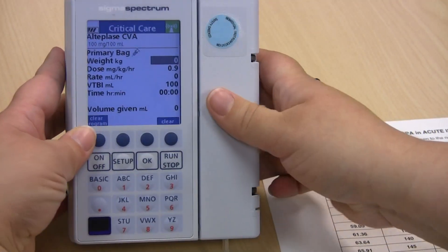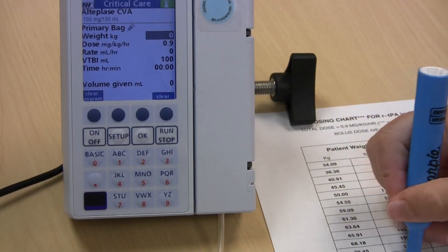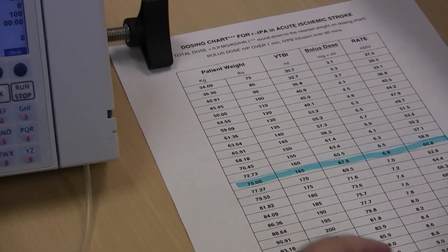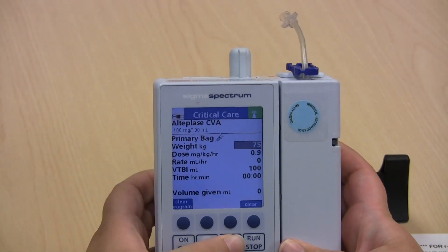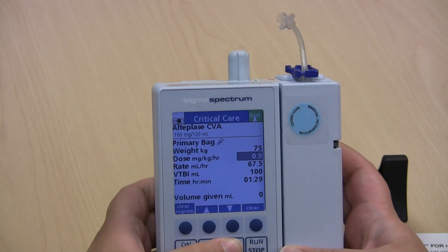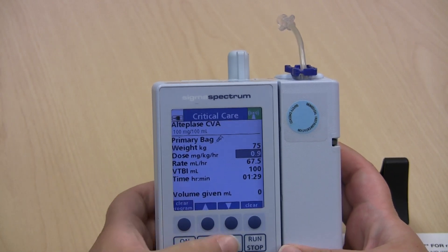Once you know your patient's weight, circle it or highlight it on your dosing chart so it's easy to refer back to, and enter your weight: 75 kilograms. Click OK to confirm the preset dose at 0.9 milligrams per kilogram.